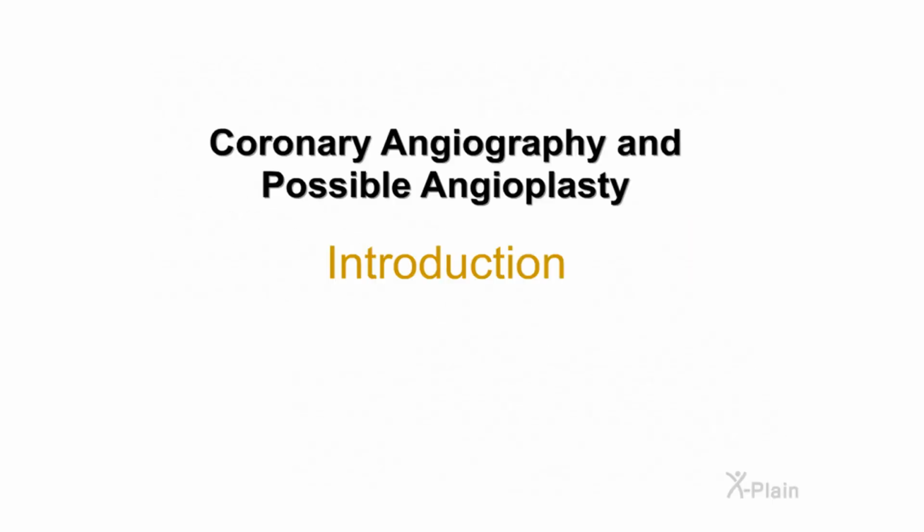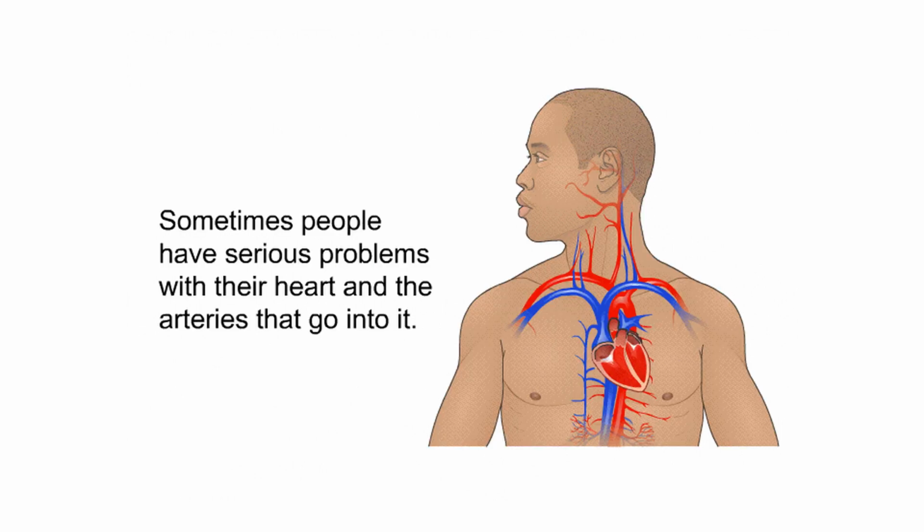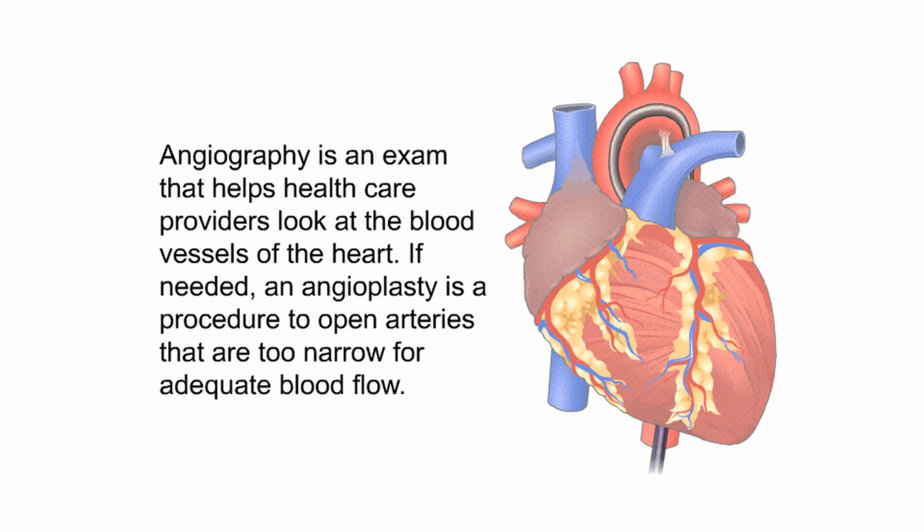Coronary angiography and possible angioplasty. Introduction. Sometimes people have serious problems with their heart and the arteries that go into it. Angiography is an exam that helps healthcare providers look at the blood vessels of the heart. If needed, an angioplasty is a procedure to open arteries that are too narrow for adequate blood flow.